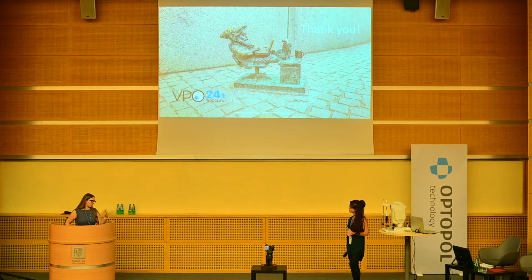I don't say that you don't stain the epithelium, but maybe perhaps skip the osmolarity, or there were some correlations with the way the meibomian glands look. So it will save us some chair time maybe in the future. But of course it will need to be investigated whether we can use a simpler device, because this camera is pretty heavy equipment.